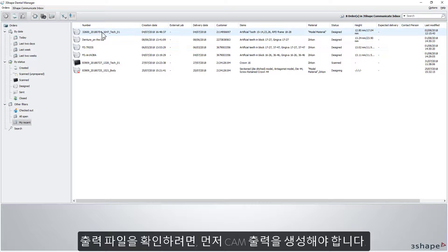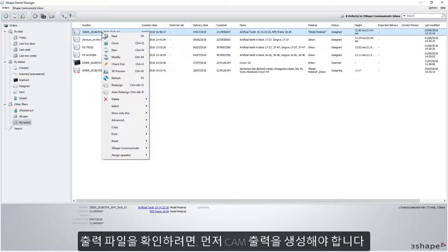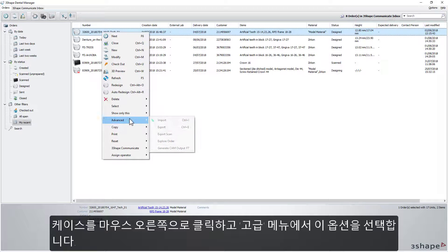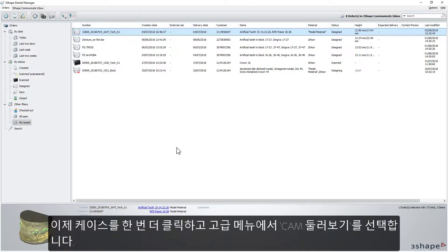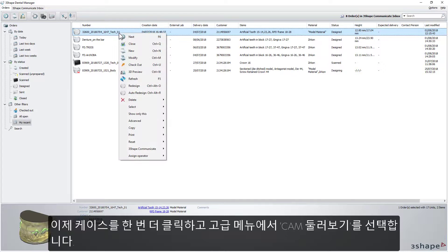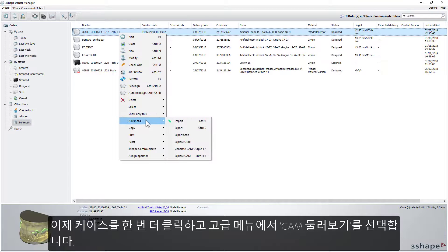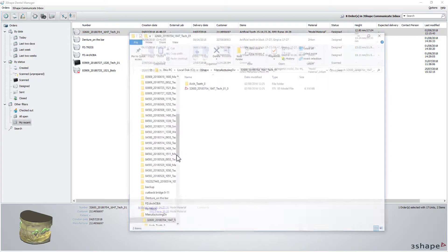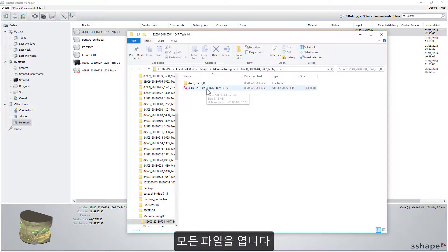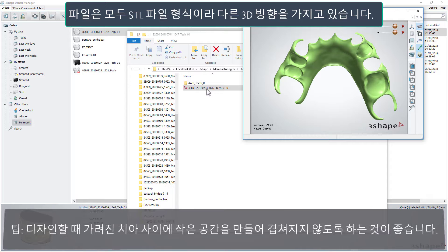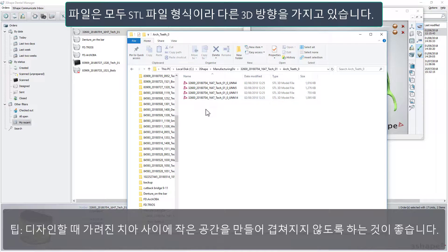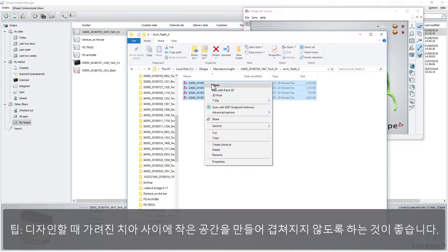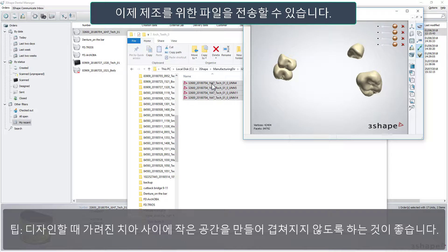To check the output files, first you need to generate the CAM output. Do it by right-clicking on the case and choosing this option from the Advanced menu. Now click the case once more, and from the Advanced menu, choose Explore CAM. Open all the files. All the files are in the STL file format, so the orientation in 3D is different for all of them. You can now send the files for manufacturing.